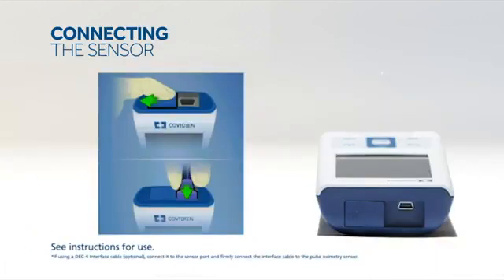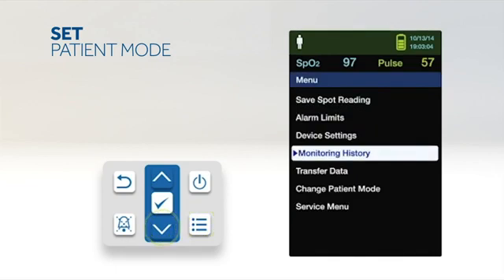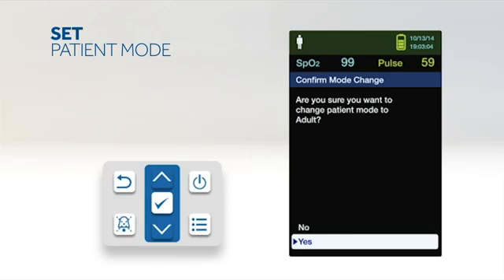To connect the sensor to the monitor, open the sensor port cover. Connect the sensor's cable to the port and attach the sensor to the patient. The patient mode can be set to either adult or neonate. To select the patient mode, press the menu button, scroll to change patient mode, press OK, select the appropriate patient mode, and press OK to confirm.